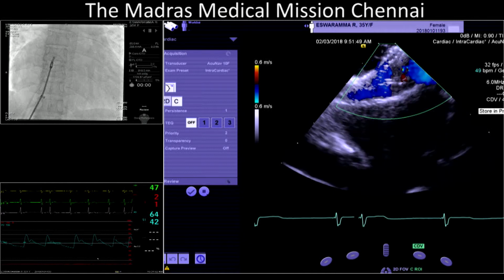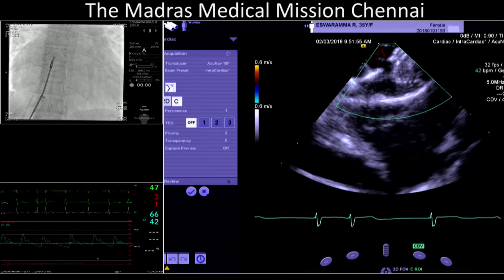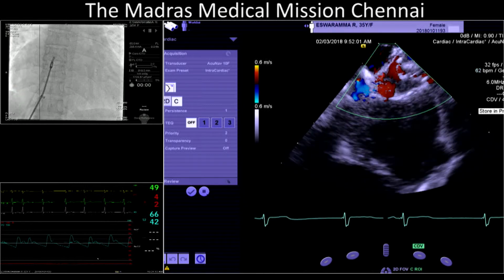Shiva, I think we have demonstrated the fenestration. We could leave you alone while you improve the pressures, and we can come back to you when you have another case. Sure. We can go back to our talks if that's okay with you. Sure. All right. Thank you very much.